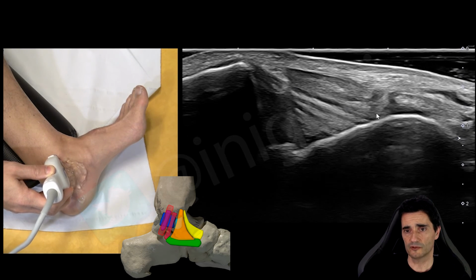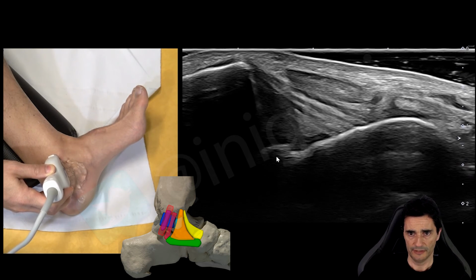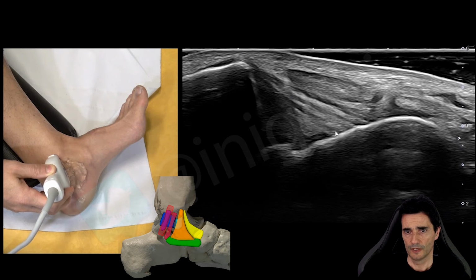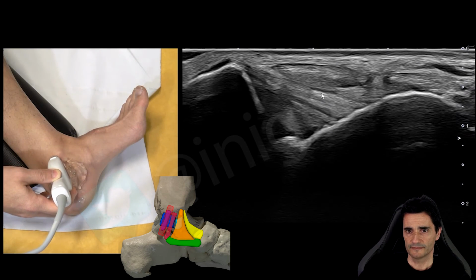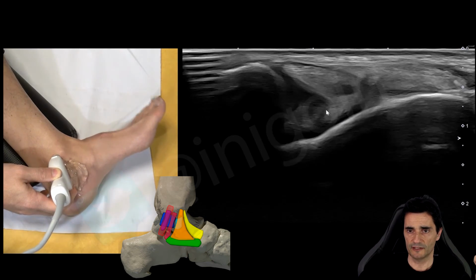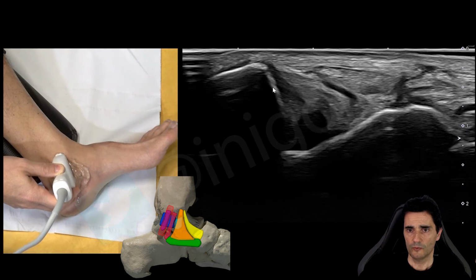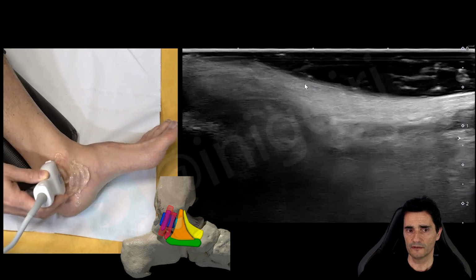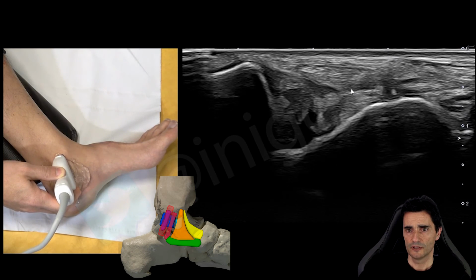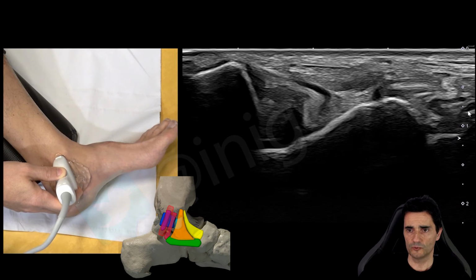And the superficial component. This is the posterior tibialis, flexor digitorum. This is the talus and this is the tibia. Okay, so this is the characteristic pattern of the posterior tibiotalar ligament. If we continue anteriorly and we check the superficial layer, we should see how this layer jumps over the talus and reaches a bone which will appear here.